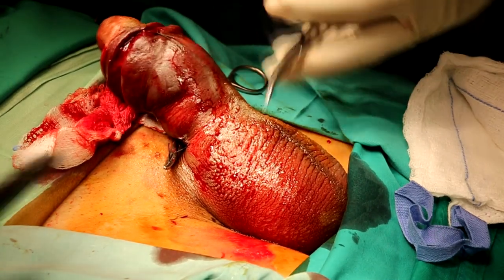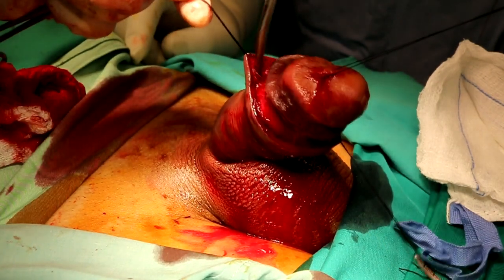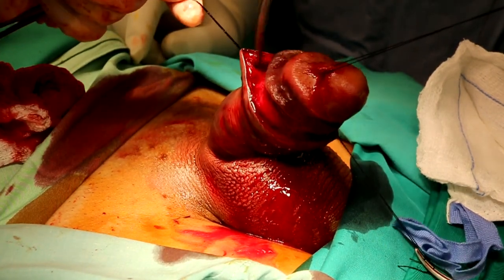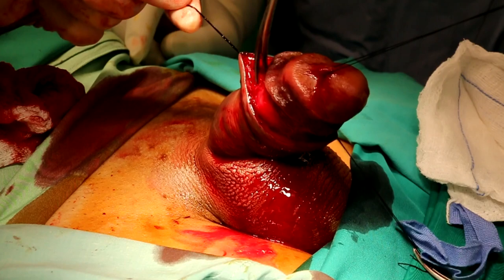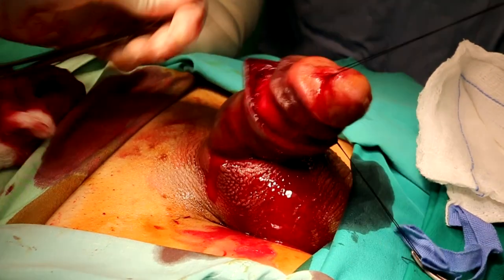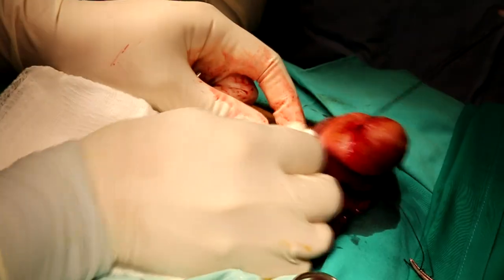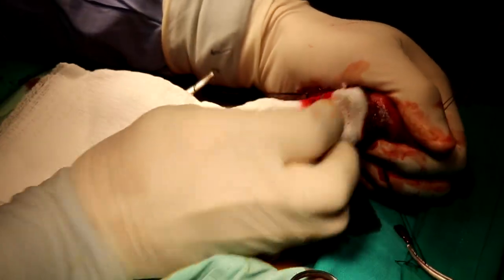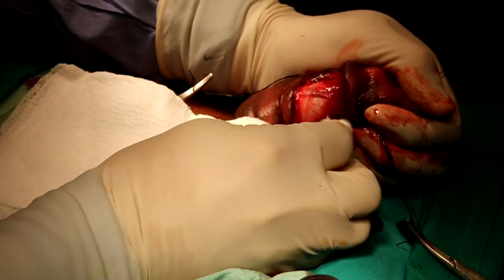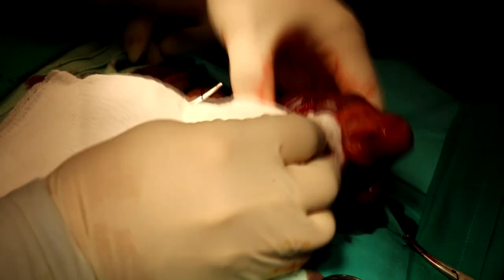I'm going to teach you a trick. You have to introduce the scissor this way, closed and then open, down to the surface of the tunica. This is the correct surgical plane. If you reach this plane, the degloving will be easier. So you see the white glistening surface of the tunica with the superficial veins. This is the correct surgical plane.